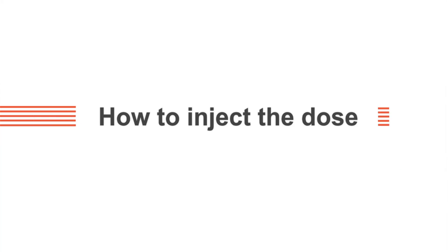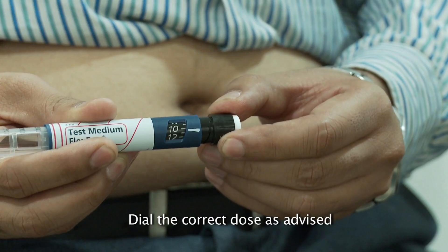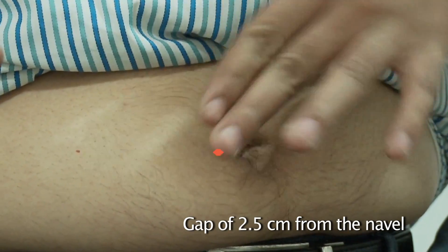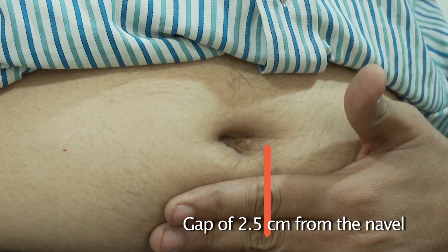Learn how to inject the dose. Roll the pen ten times in between your palms. Dial the desired dose. Select the site for the injection. For instance, if you choose the abdomen as the site, administer the injection about two and a half centimeters away from the navel.